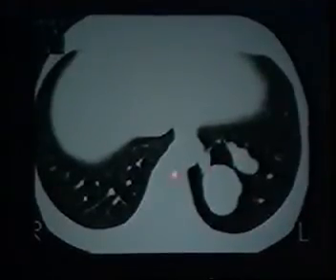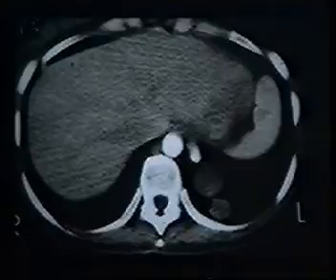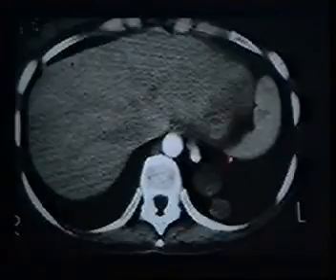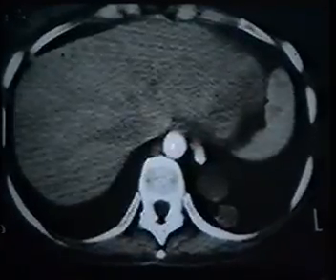We see branching, dilated airways, mucus-filled, and the surrounding lung here is obviously hyperinflated. If we compare the density of this left lower lobe to the right lower lobe, clearly this is a hyperinflated lung. The difference between bronchial atresia, however, and the sequestration is shown here. This is a bolus study at the level of the base of the lung, and we can see the very characteristic features on CT of clearly dense opacification of the aorta, as well as this anomalous vessel which arises from the aorta.